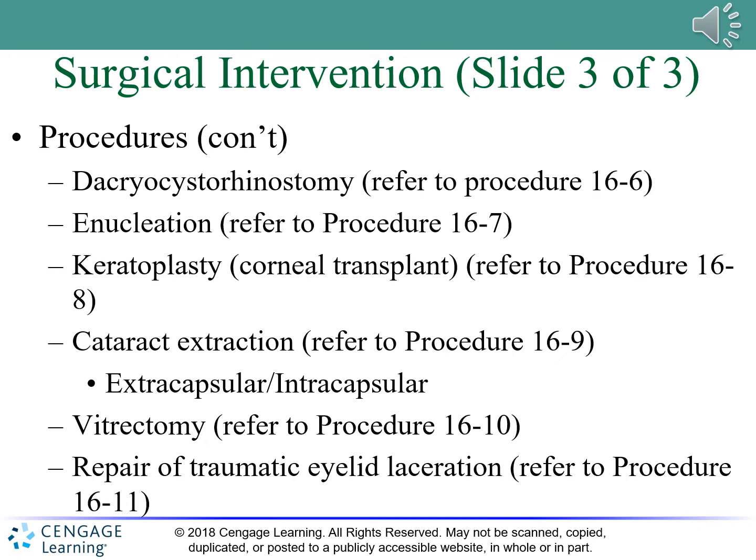Okay. All right, so number 4 on page 612 in red, a trephine, and a trephine is a cylindrical saw for cutting a circular piece of bone. And you can see that on 613 on A, there's that trephination. Okay, I have that circled and underlined. A trephine is placed on the cornea and is used to make the corneal cut around the cornea and into the anterior chamber. Okay.